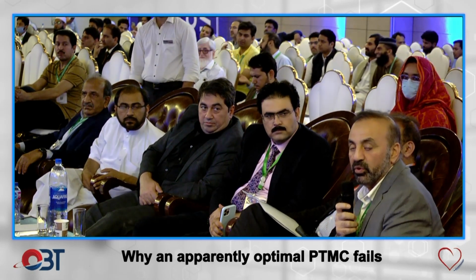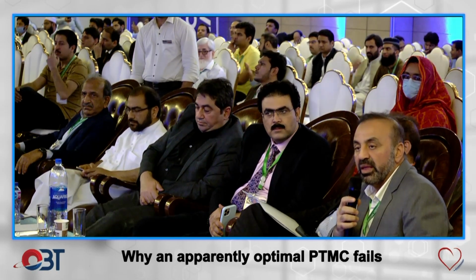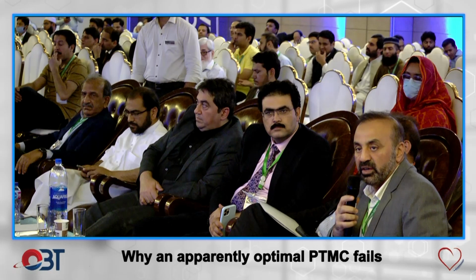That's what I am thinking, because usually post-procedure you do pressures again and they will tell you whether you're perhaps properly dilated and taken care of the obstruction or not. So, any other comment? One of the predictors for a successful PTMC is that you should do the Wilkins score before doing the PTMC. If the Wilkins score is high, there is a lot of chance you will end up with an unsuccessful PTMC, and the chances of a redo PTMC in the future are very high.